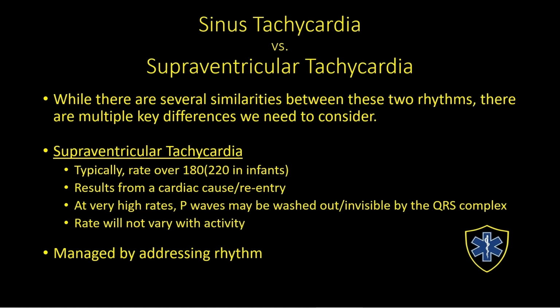Now, differentiating between sinus tach and supraventricular tachycardia does take some time and practice to get used to. However, think about, what is the story? Does the story or the history of the incident indicate that this is something the child or the patient is compensating for? Or is the story or the history devoid of any possible causes? We're not seeing anything that would cause this, and therefore maybe it's a cardiac cause.